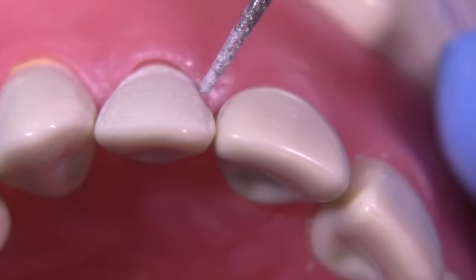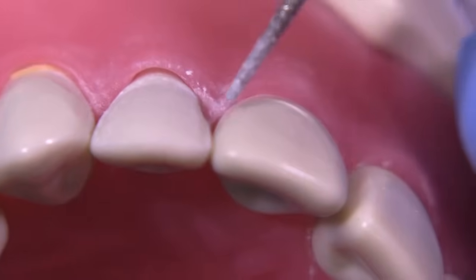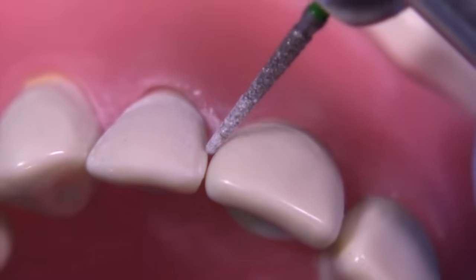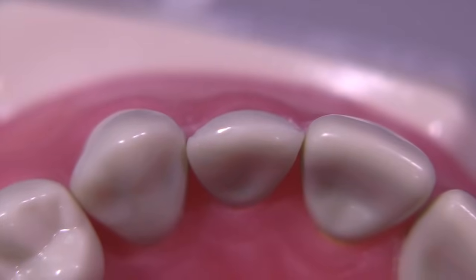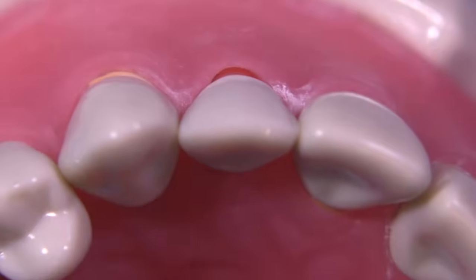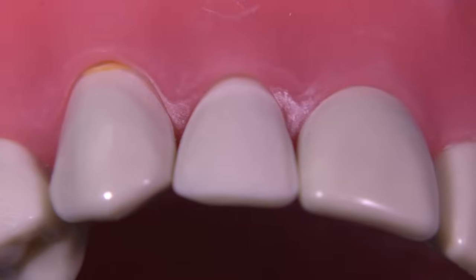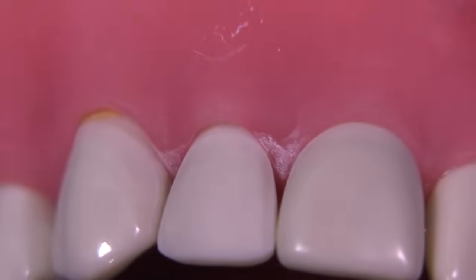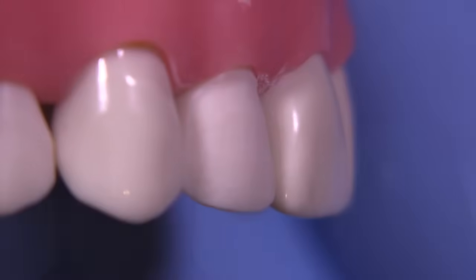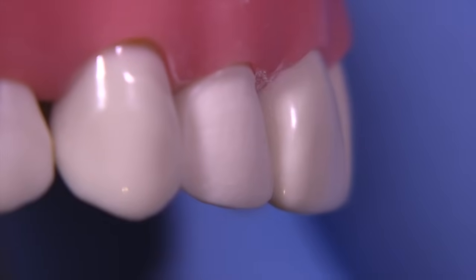Remember that the line of draw of this preparation is going to go off towards the facial. So undercuts, as you view from the incisal, will be common, and that's completely acceptable. Let's always remember to look at things from the side view, so we're following the contours. And also keep in mind that undercuts are going to be tolerated because the line of draw is going to come off more towards the facial, so the veneer will seat pretty easily from the facial.